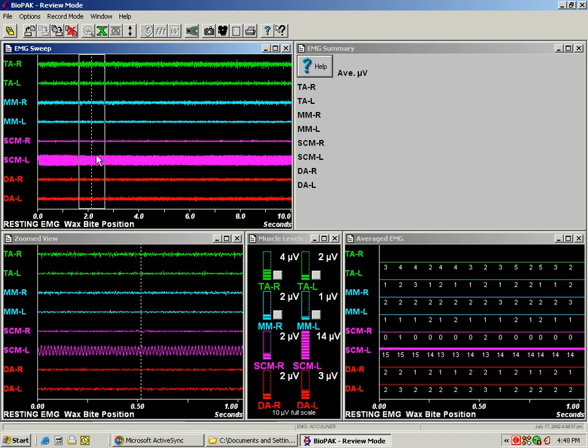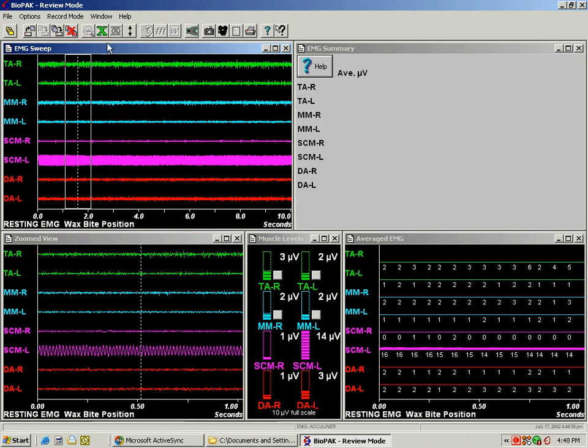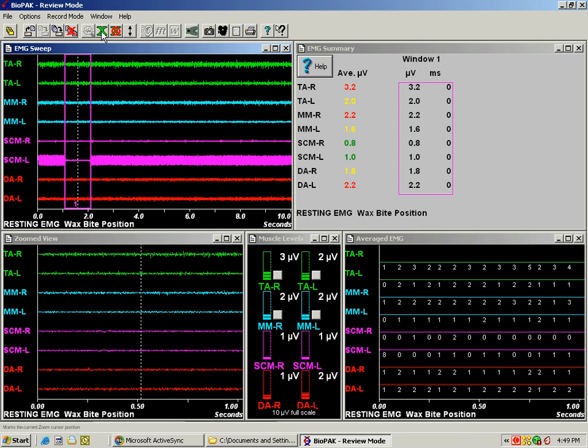But whenever we take our cursor and we actually mark an area to measure the muscle activity in that area, the Noise Buster actually goes in and finds that 60 cycle noise and cuts it out. So as long as you still have a good electrode connection and all your wires are plugged in correctly, you will still be able to record the muscle activity that is masked by that electrical interference and it won't pose a problem to your EMG.